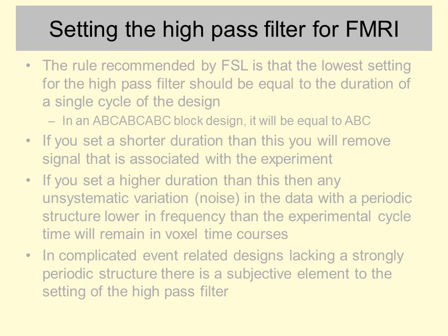So that's a slightly higher frequency signal but still lower frequency than the experimental signal. And then there are low frequency periodic signals in that data which we couldn't really identify the source of, but we were able to remove them anyway.